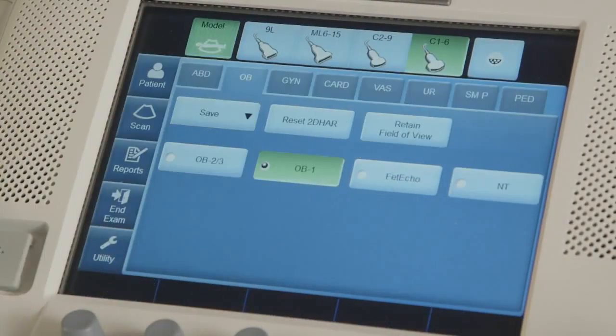Fill in the pertinent information such as LMP, EDD, Gravida, Para, or change fetus number. In this section, the operator initials can also be changed by selecting the down arrow to the right of the operator initial field.